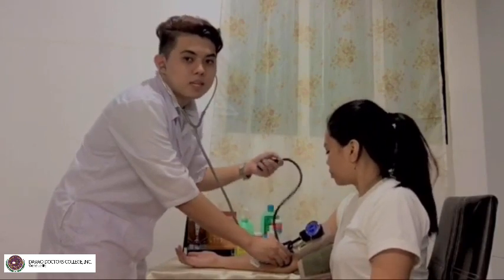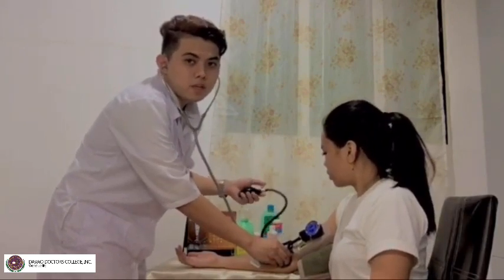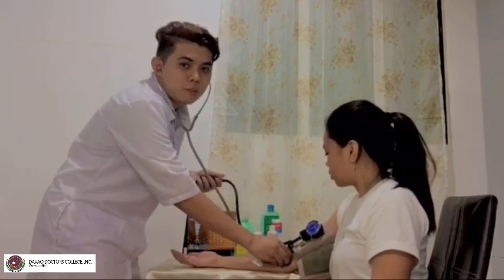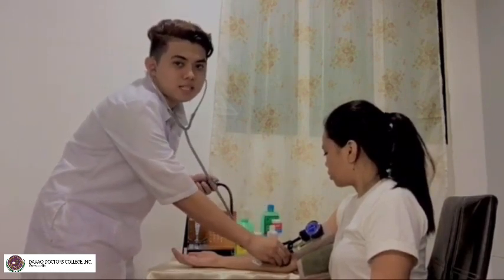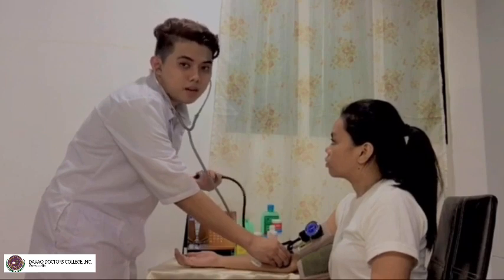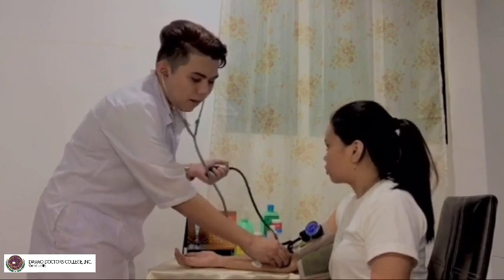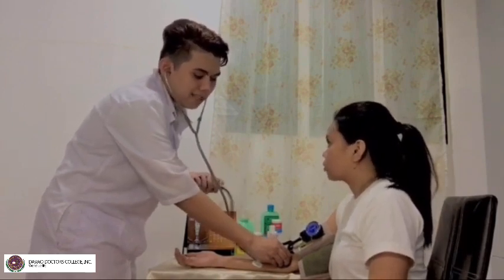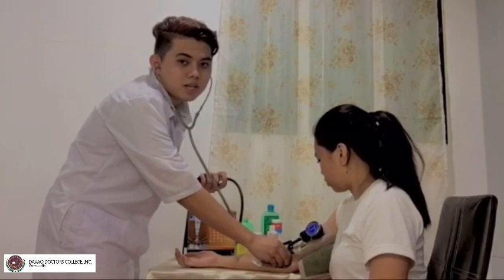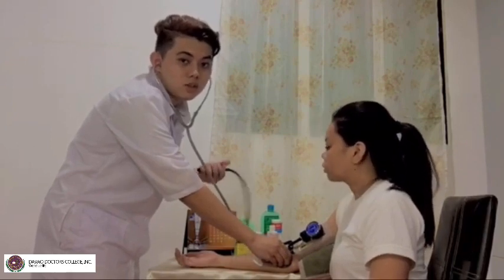Okay, sige. So now we need to auscultate the client's blood pressure. Pump up the cuff until the sphygmomanometer reads 30 millimeters of mercury above the point where the brachial pulse disappeared. A while ago it was 180, so plus 30 we'll be having 210. Release the valve on the cuff carefully so that the pressure decreases at the rate of 2 to 3 millimeters of mercury per second.